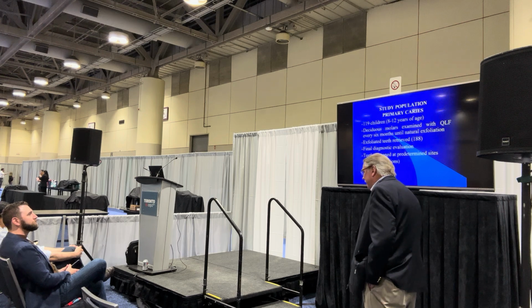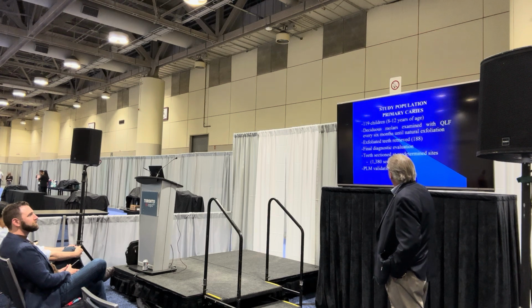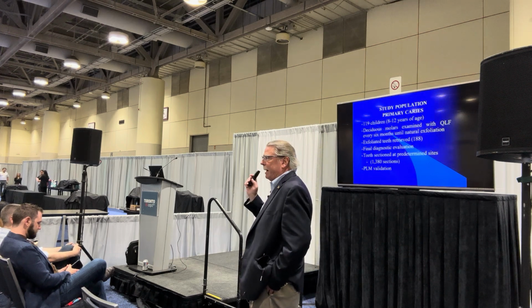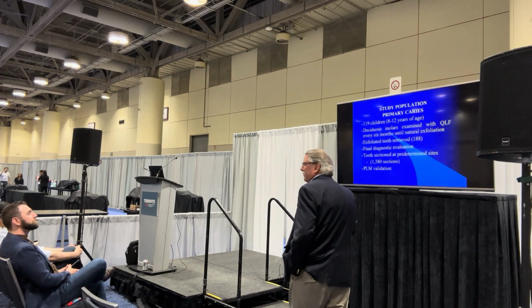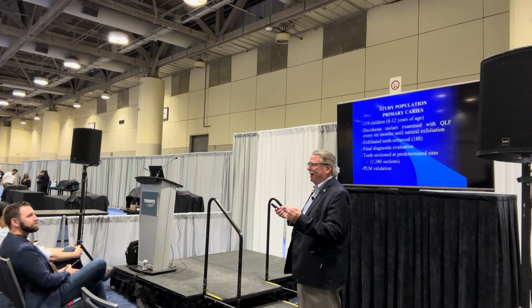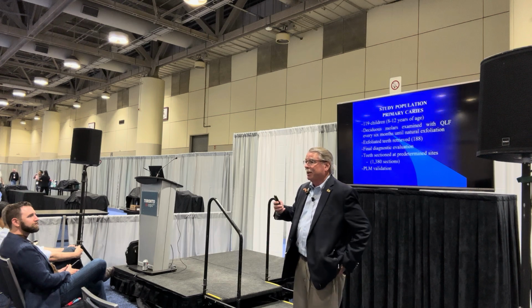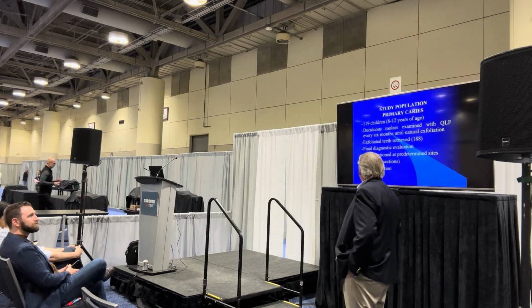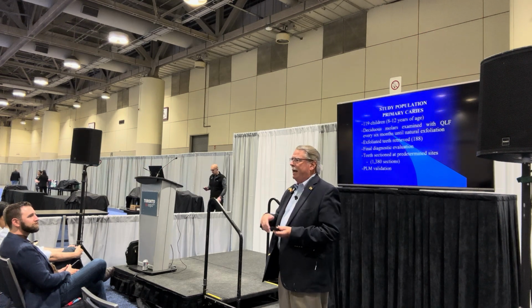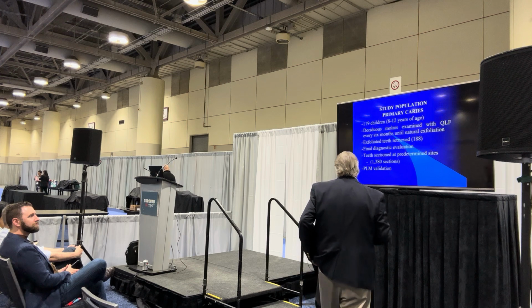So we started this next phase of our study with 119 children, 8 to 12 years of age. We examined their mouth with QLF, and when we saw early lesions, we'd snap a shot and save it. Now think what you have on your phone right now, how much you can store on that. We had one of those boxes that stood like this tall and this wide to save the images because it was so cumbersome at that time. But then when the kids sent us their teeth back, we had predetermined sites that we knew we were going to section and validate with polarized light microscopy. And so we did that, a lot of sections.